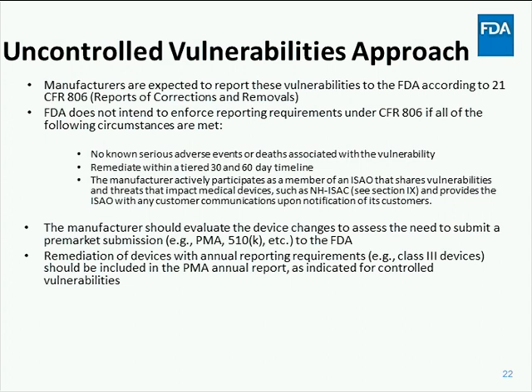Having already discussed the criteria regarding adverse events and active participation in an ISAO, I'd like to discuss the time frame for mitigating risks, including remediation. Recognizing that vulnerability assessments, risk assessments, and validated remediations can take longer than 30 days, the FDA expanded the time frame to a 30 and 60-day tier. FDA's intent for keeping the 30-day time frame is to encourage manufacturers to provide immediate risk reduction, which could include communication to customers and users, as well as compensating controls, and, most importantly, to develop a plan for further risk remediation.